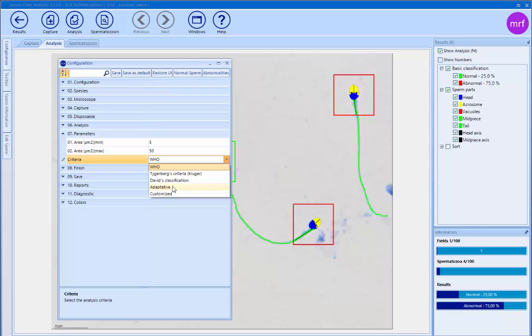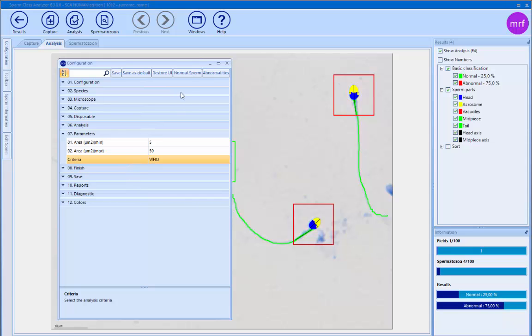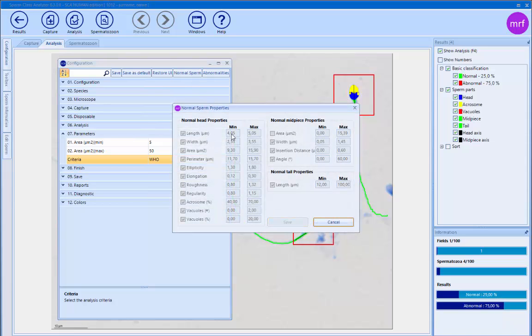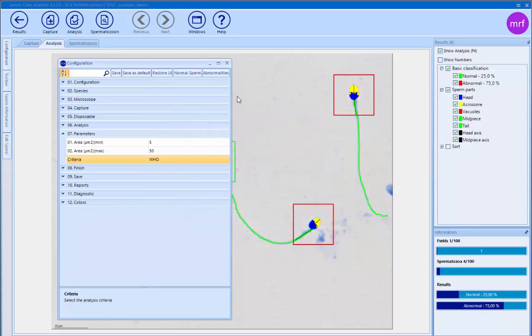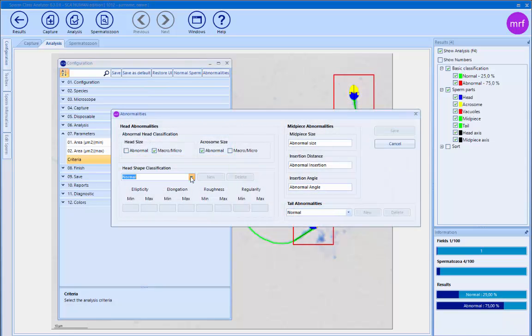Depending on what you select — for example WHO — you have here the different parameters defining when a sperm is normal and when it's abnormal, and also for the abnormalities: when it's wrong, when it's thin, and so on.